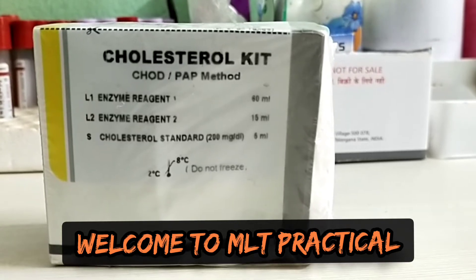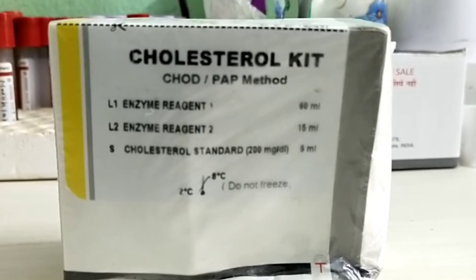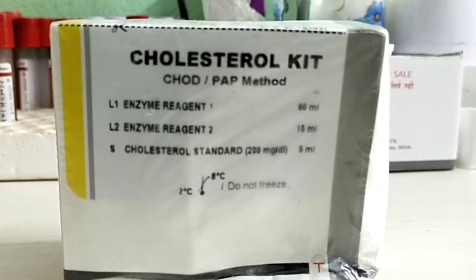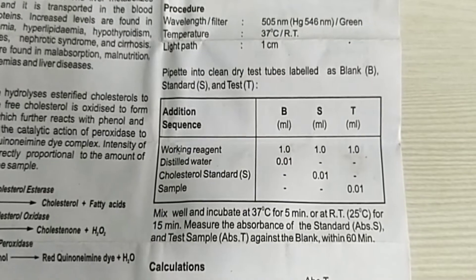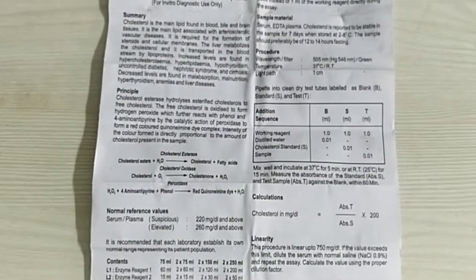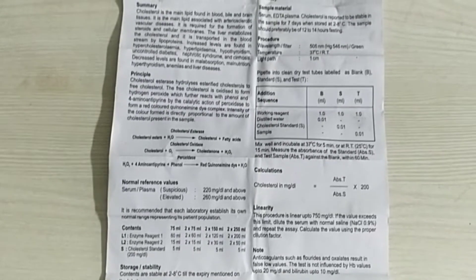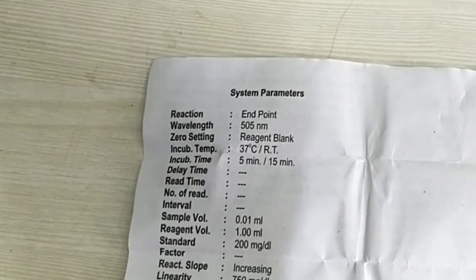Hello, welcome to MLT practical. In this video I will practically demonstrate how a blood serum cholesterol test is done by colorimeter. Before the test starts, always follow the reagent box protocol. For this test we need working reagent 1000 micro liter, distilled water 10 micro liter, standard 10 micro liter, and serum sample 10 micro liter. The colorimeter wavelength is 505.